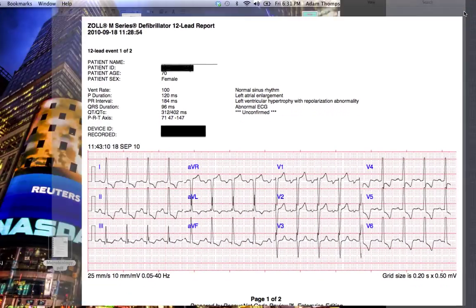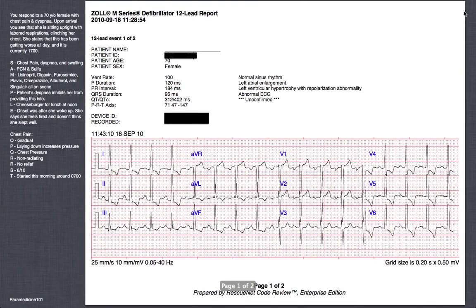Hello, let's take a look at this 12-lead from Paramedicine 101, the Facebook page. If you saw it, there's a case presented with it, so let's look at the case.